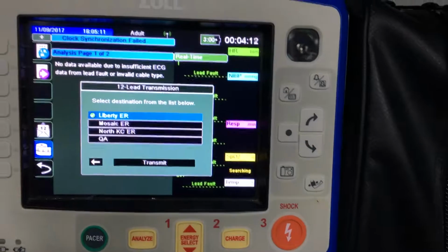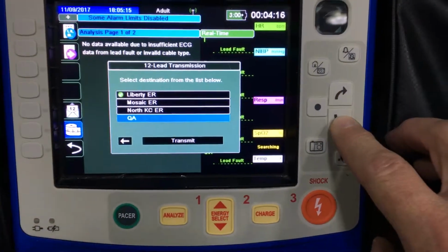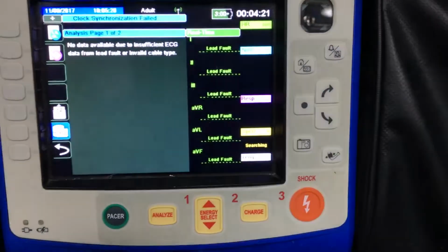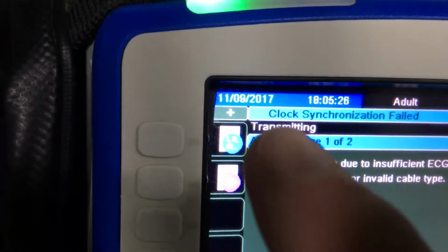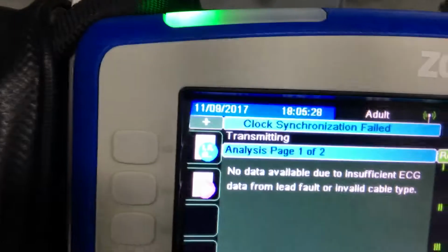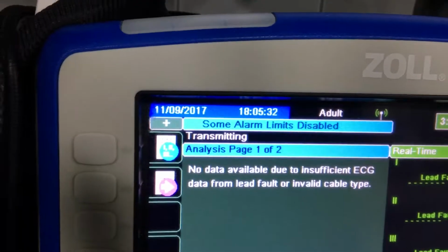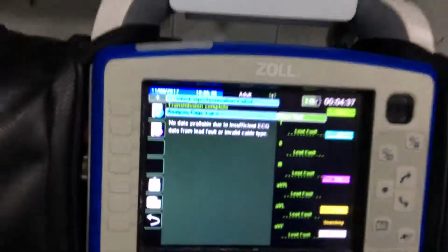Hit right here. And you've marked it. Come down, scroll down to transmit, and you hit transmit. And right up there it says transmitting. It'll either go through or it'll fail. Transmission complete, so it went through.